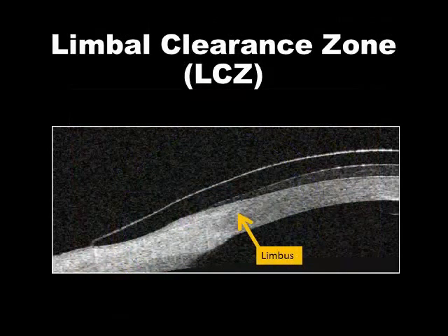And in the OCT you can see this where we've marked the limbus in this area and the ICD vaults through that area. Notice how there's much more fluid in the center, then the lens is bringing itself back toward the conj, but in between we're hoping to see this area of vault in between, and that's how we attempt to protect the limbal stem cells.